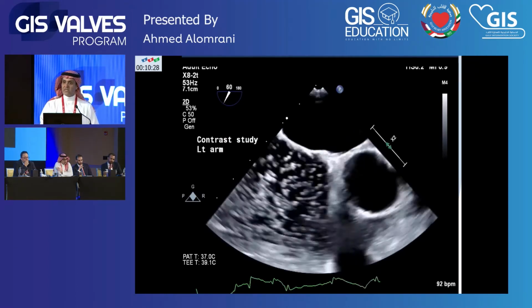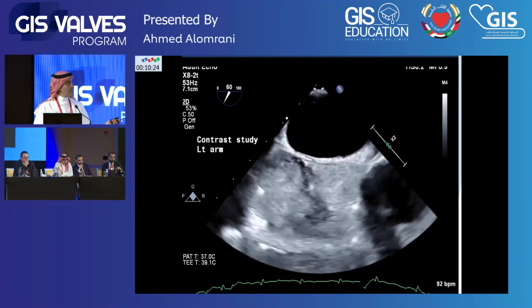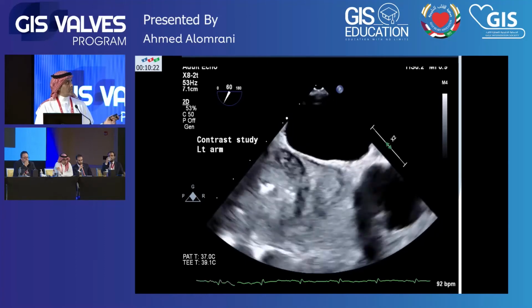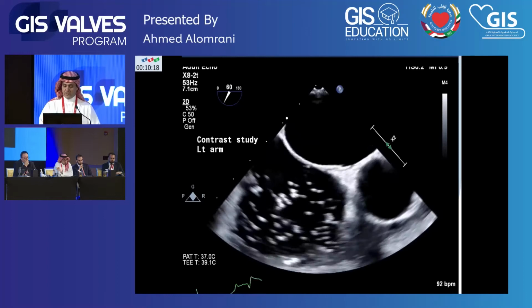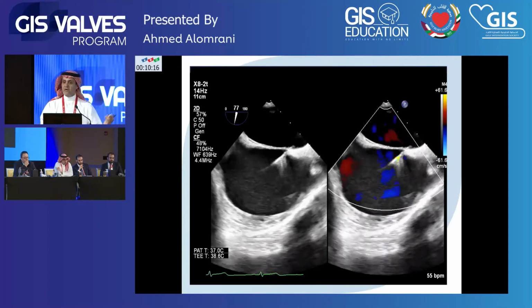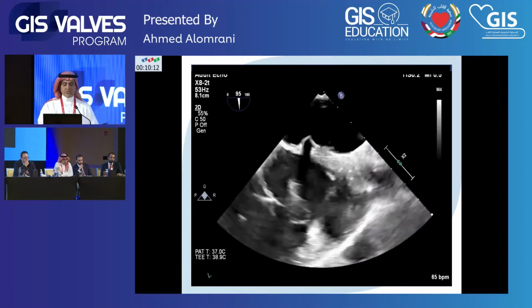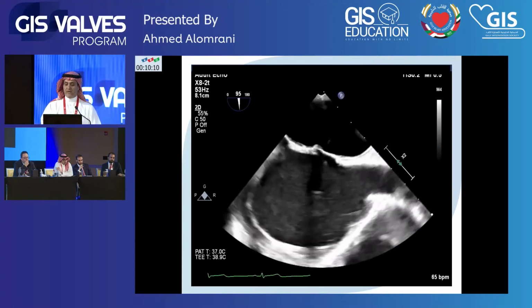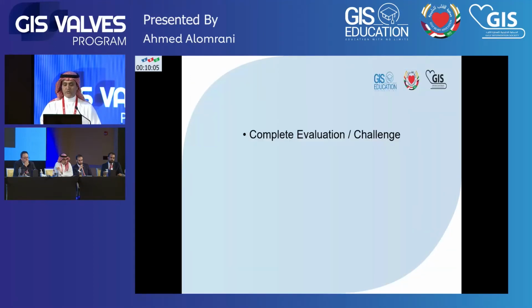In our practice we have a transesophageal echo appointment as an outpatient for them, so you can do a bubble study and assess a right-to-left shunt, positive like this patient has. Then you can basically direct him to the cath lab, do an assessment, try to probe that defect, and then you will be able to close it.